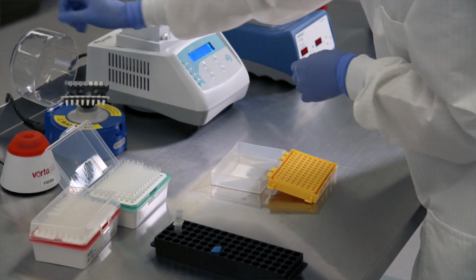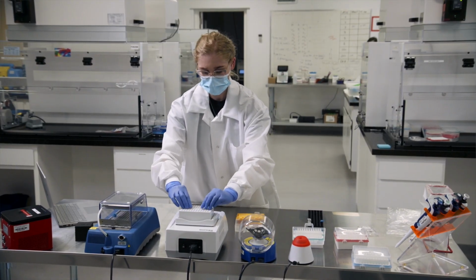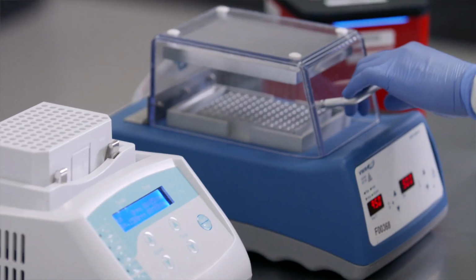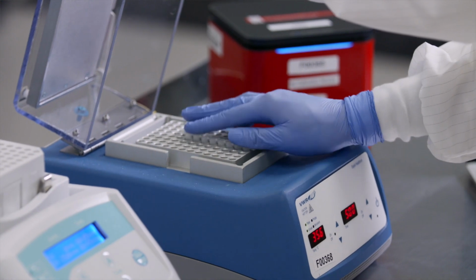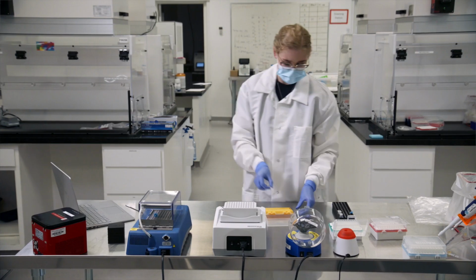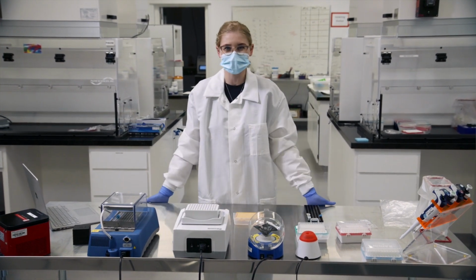You will then cover your samples, briefly centrifuge, and then vortex for 1 minute. After vortexing, you will briefly centrifuge your samples again, and then place them in the heat block or thermocycler to sit at 95 degrees for 5 minutes. Allow your sample to reach room temperature before plating with your Co-Diagnostics Logix Smart reagents. The samples can then be processed through normal PCR, just like any other extracted material. That's the simplicity and beauty of using the Co-Diagnostics Logix Smart Direct Saliva.